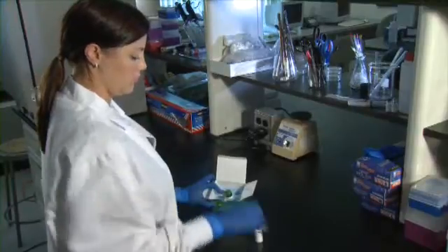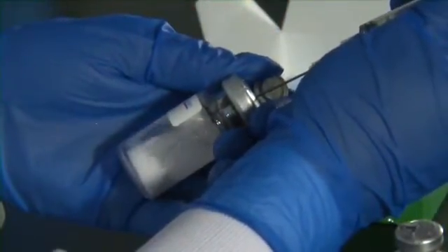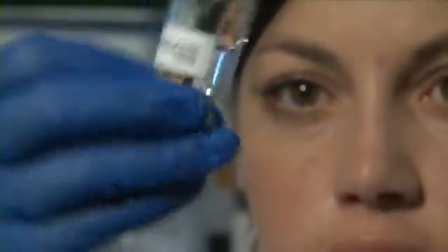To make a hydrogel, just follow four simple steps. Step 1: Resuspend the contents of each vial with sterile water provided in the kit and shake for 30 minutes. The contents of each vial will become clear and uniform.